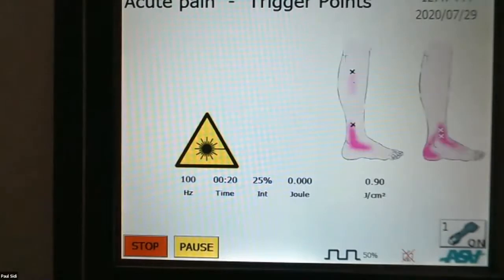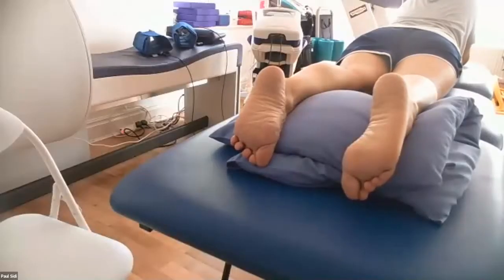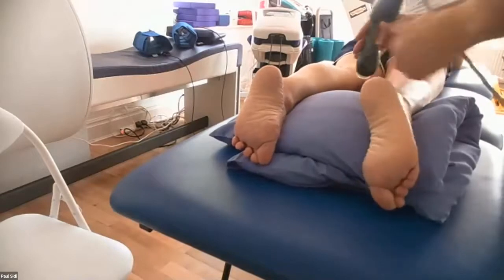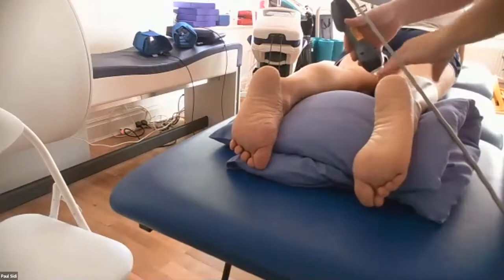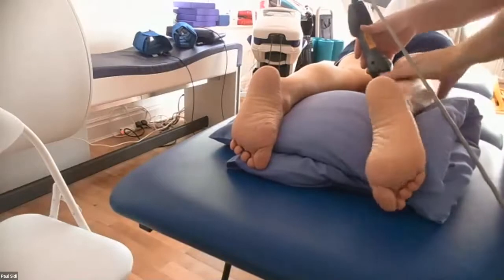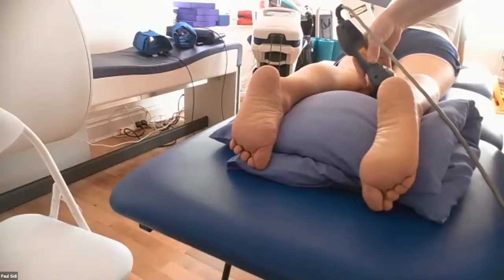And we're going to go back to the other camera. And what we do is we get back in that area where, let's move around. Right there, yeah, a little bit sore. Medial head of the gastroc, as I told you. And that will often refer pain right down into this region here. And you can be involved with that, that problem. So let's get on that trigger point. We just hold it there.